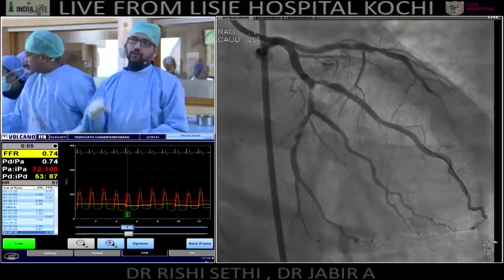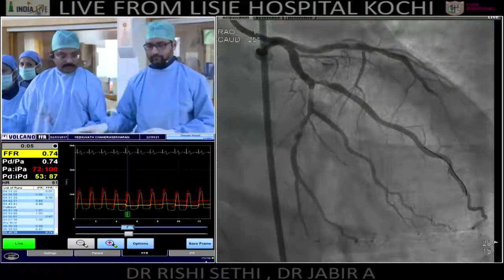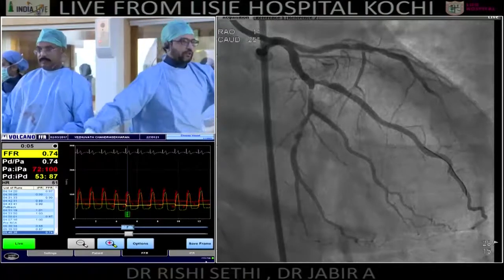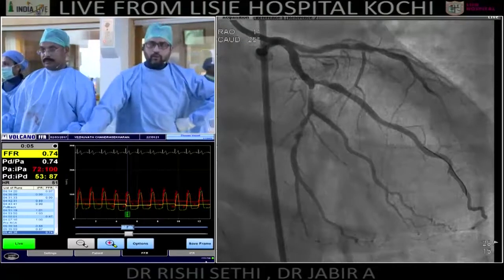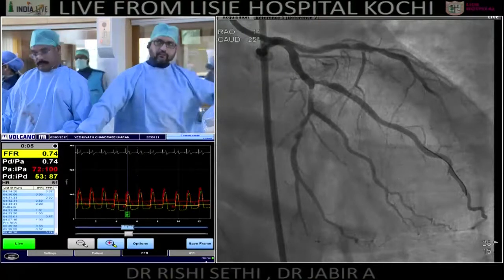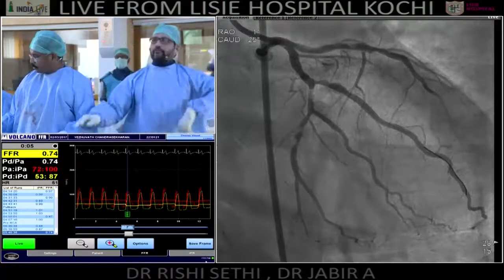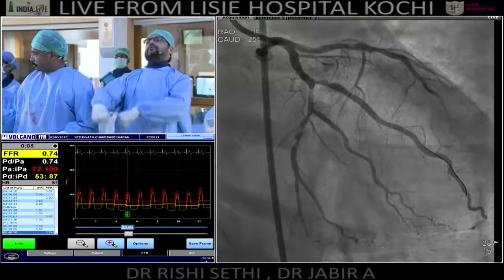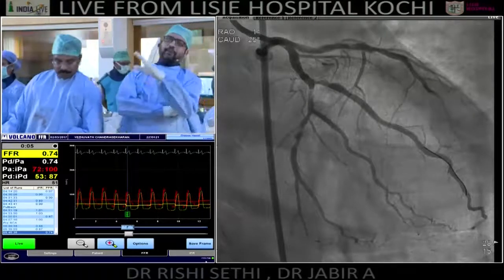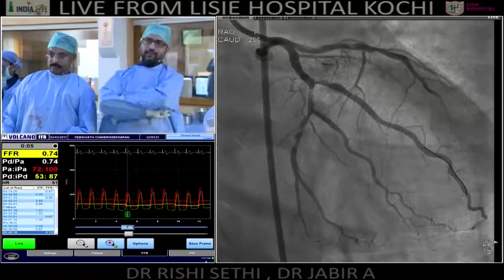Rishi, do you think you're going to gain ischemia in the distal? Brian, yeah, go ahead. Do you think you're going to gain anything by trying to reperfuse a minuscule obtuse marginal? You mean the lower one? That's right. Do you think the patient is going to benefit by a PCI? The circumflex into the lower one. The surgeons would certainly not have been able to even find that obtuse marginal on the table. You mean the circumflex, right? It means the circumflex and the third OM. Going into the third OM, no?